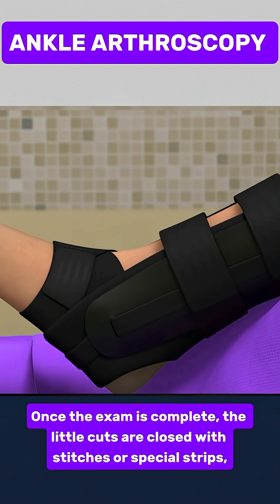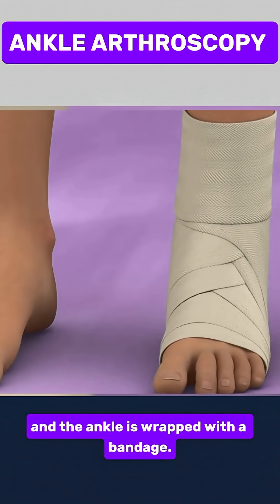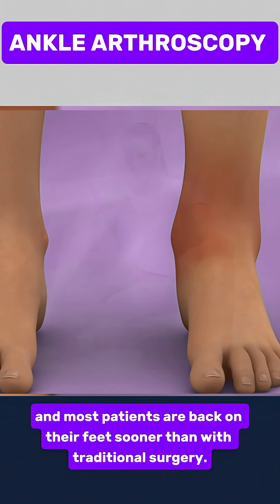Once the exam is complete, the little cuts are closed with stitches or special strips, and the ankle is wrapped with a bandage. Recovery is usually fast, and most patients are back on their feet sooner than with traditional surgery.